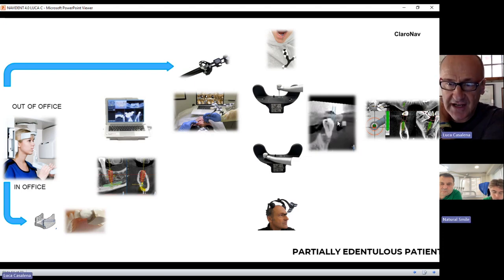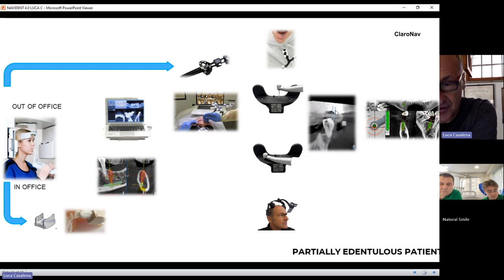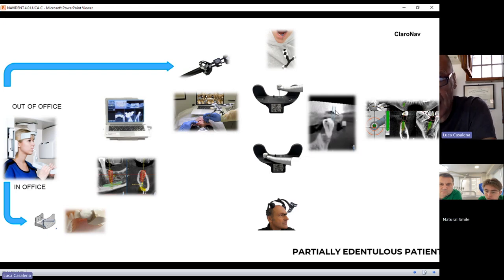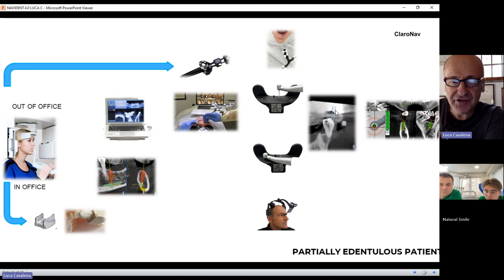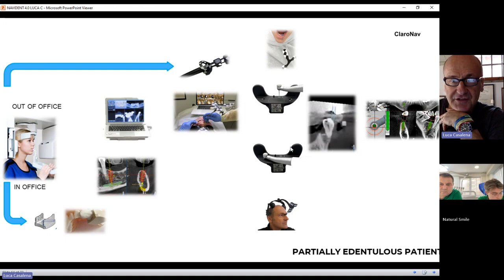If, for example, you touch a cusp and the computer screen shows you are away from that cusp, there is an incongruency — there is an error and you need to fix it before surgery. You need to carry out the accuracy check after each procedure: after finishing tracing, you touch the cusp and verify accuracy. After calibrating the contreangle axis and the length of the drill, you again need to do an accuracy check.